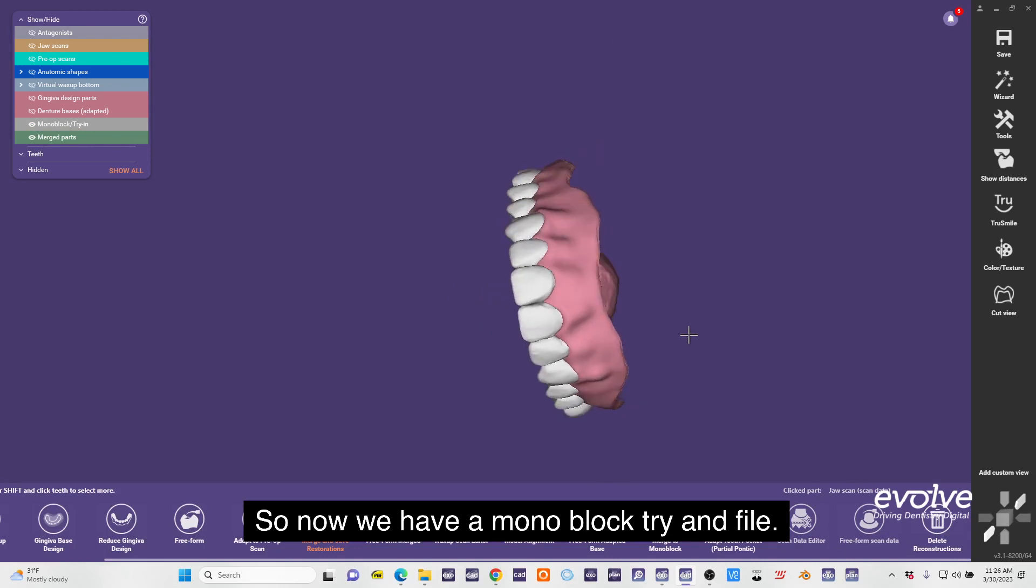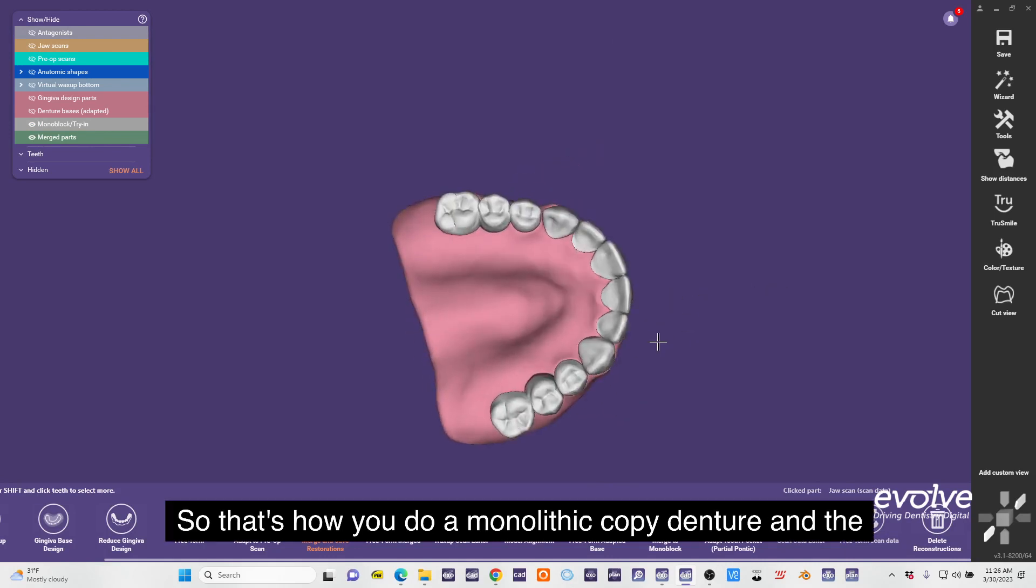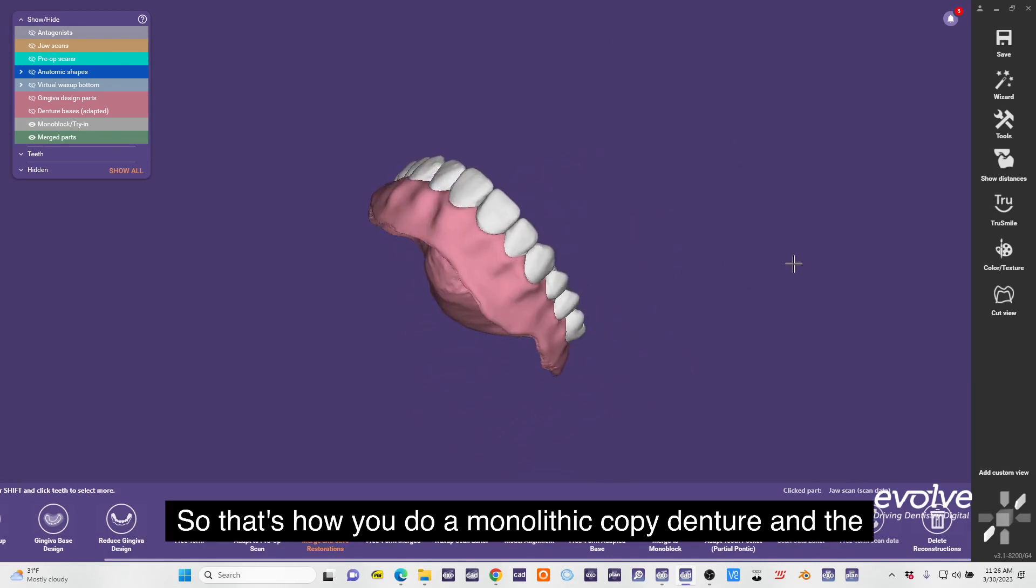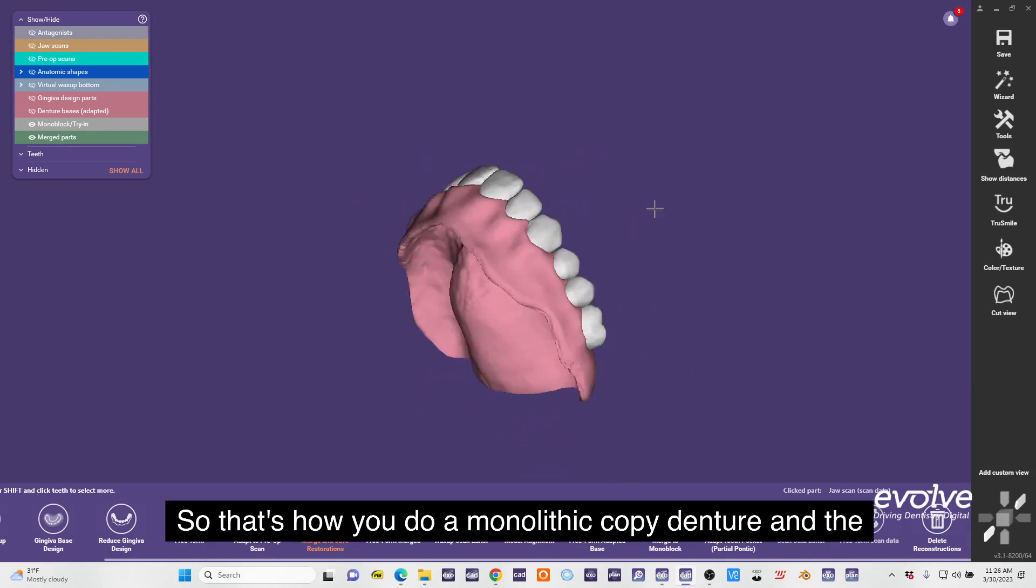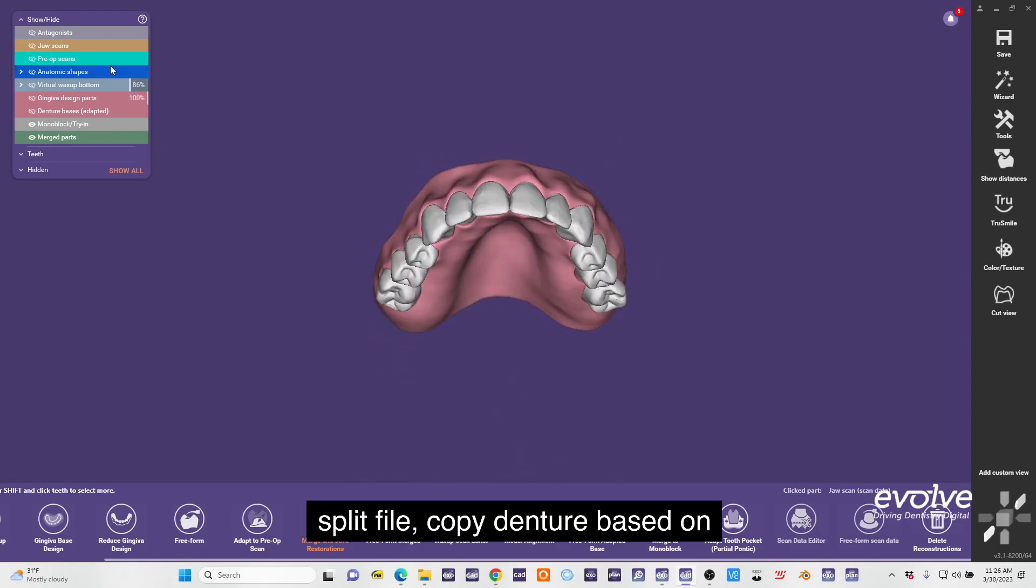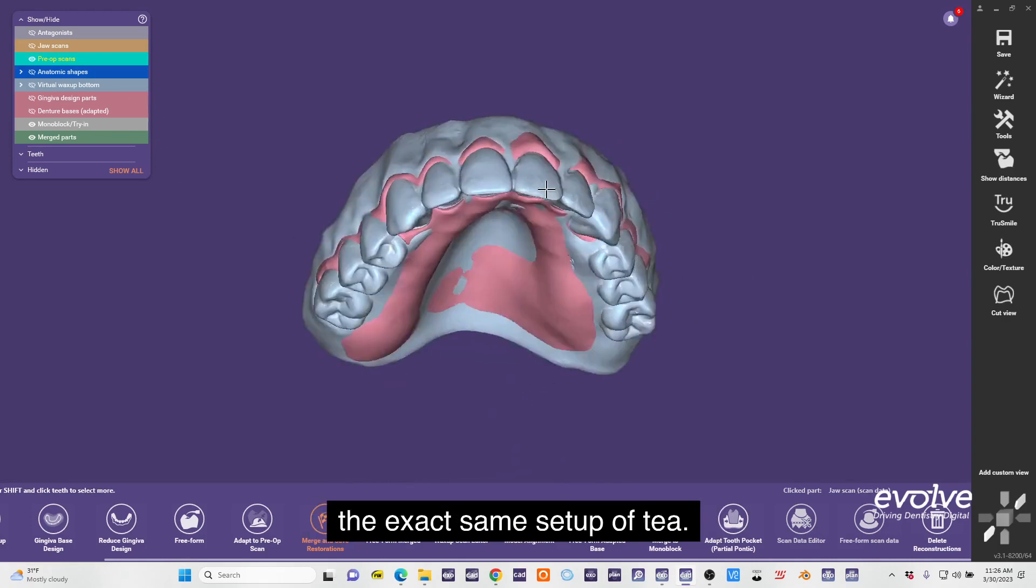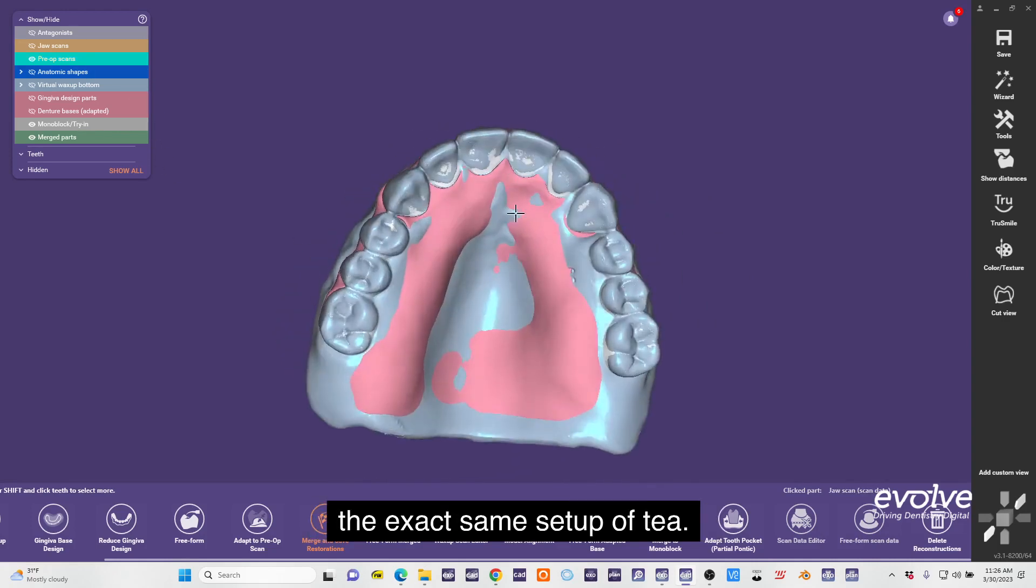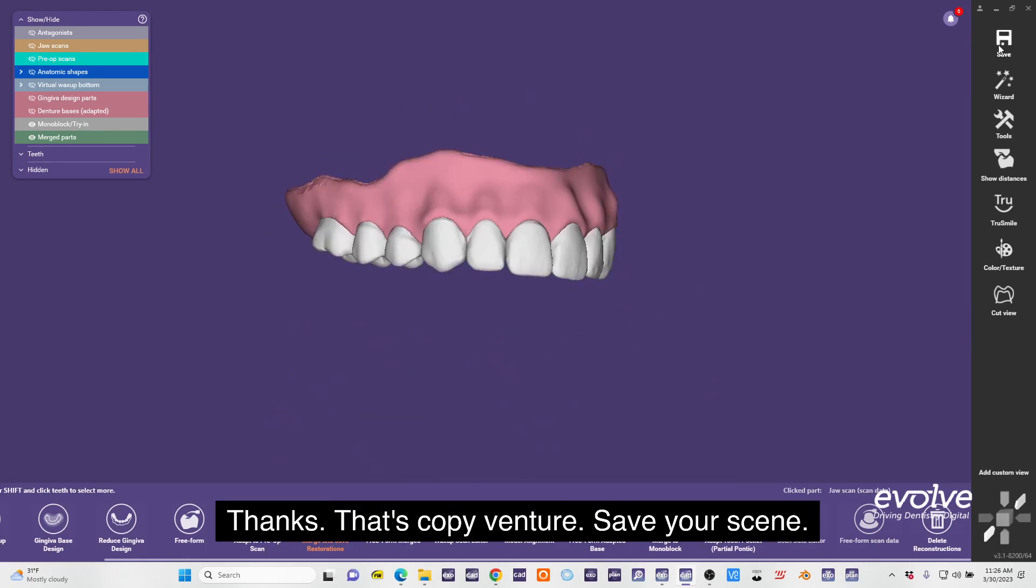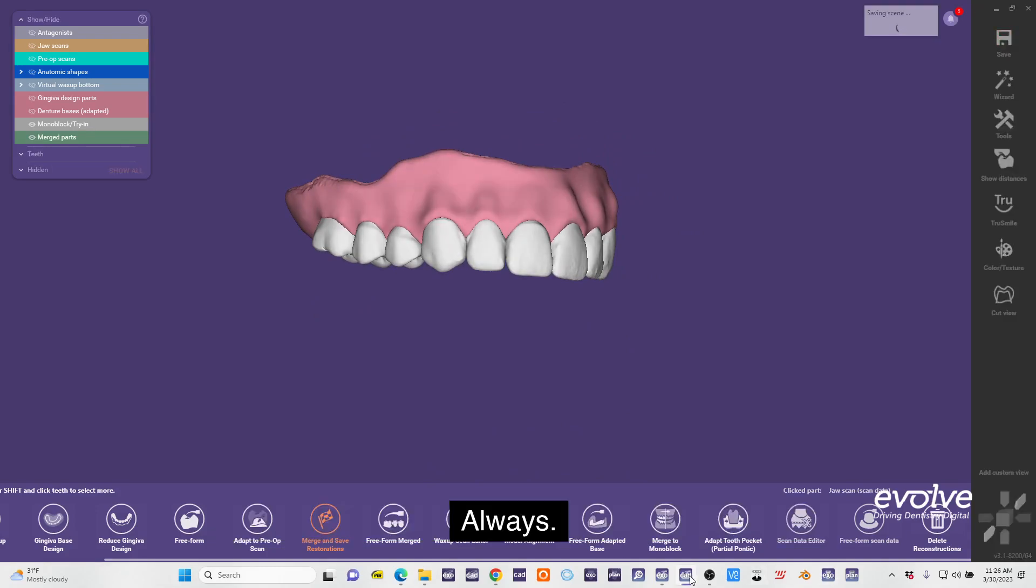Trion file. So that's how you do a monolithic copy denture and the split file copy denture based on the exact same setup of teeth. Thanks, that's copy denture. Save your scene, always.